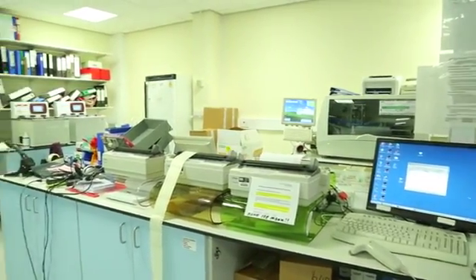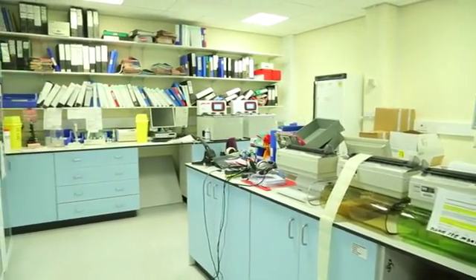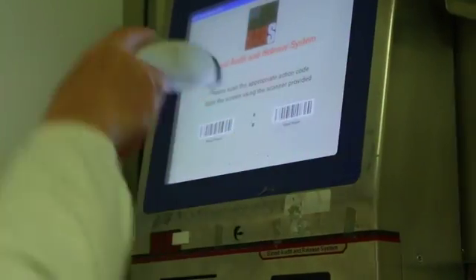So in a year, how many tests do you carry out and how many transfusion requests do you generally get? Well, in a year we do about 26,000 blood groups, and out of those we transfuse about 8,000 units of blood components, and that would be either red cells, plasma or platelets. Why is it important to get the correct ABO group?